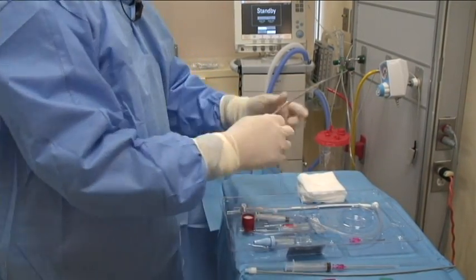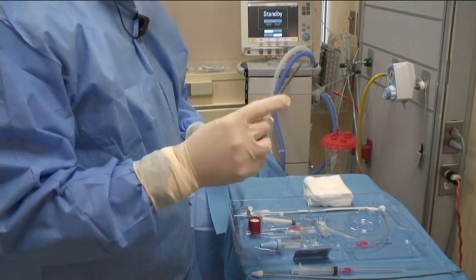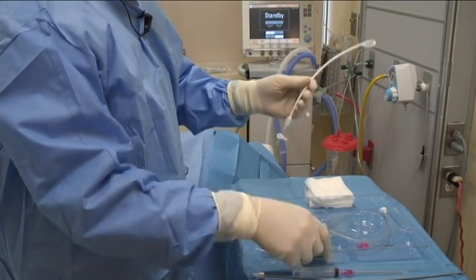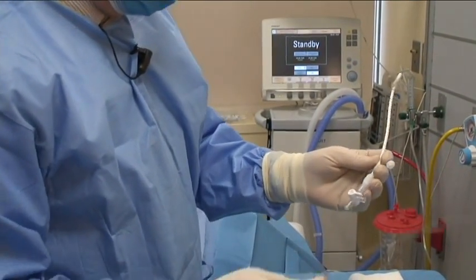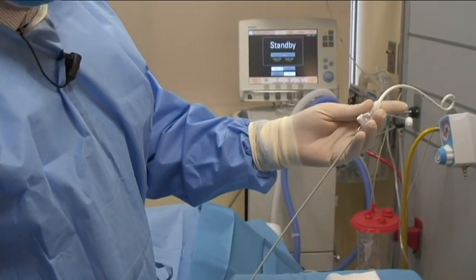We have a dilator, which is an important step for actually dilating the tract to put the chest tube in, and ultimately, this is the chest tube that we're going to put in. Now, it's important. This is called a pigtail catheter because the end has a curve to it. And before you do anything, you'll see that it has a stopcock on the end, and you need to straighten out that curve in order to put the tube in.